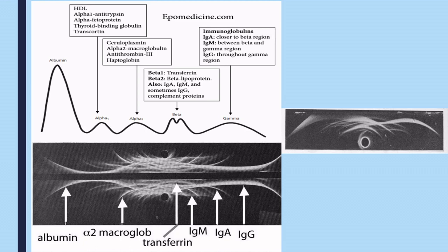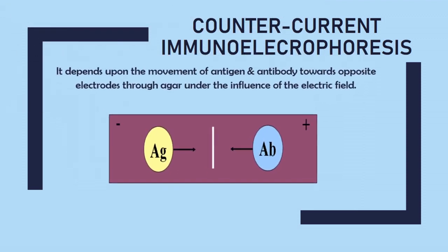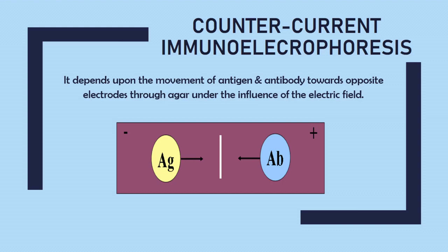If you have understood immunoelectrophoresis, let us understand countercurrent immunoelectrophoresis. Now, when I say countercurrent, what comes to your mind is something that is flowing against the current. So we have two flows actually. One in the direction in which antigen moves, and in the opposite direction, antibody moves. Why we are doing this is because we want faster results. As I said, we always try to modify the method in order to get a better result. So by doing this, we are making them run towards each other.